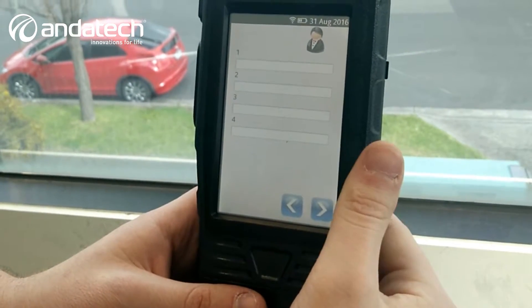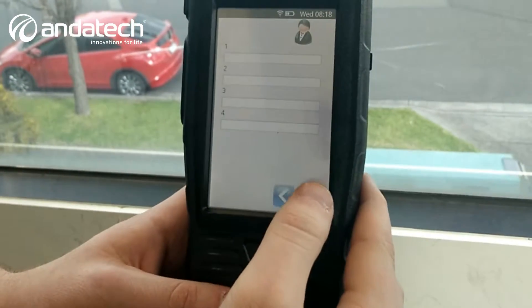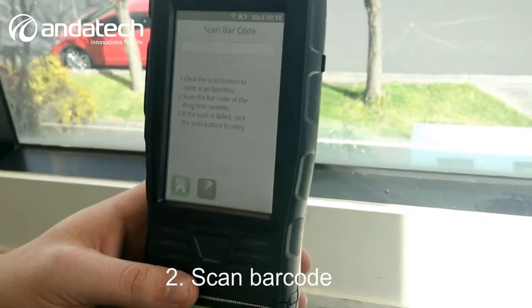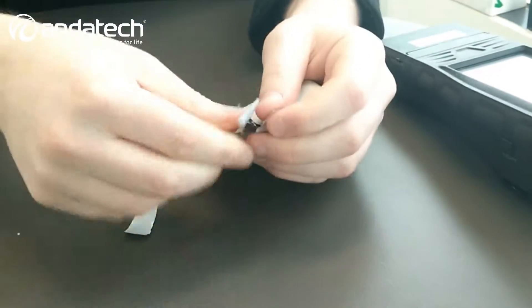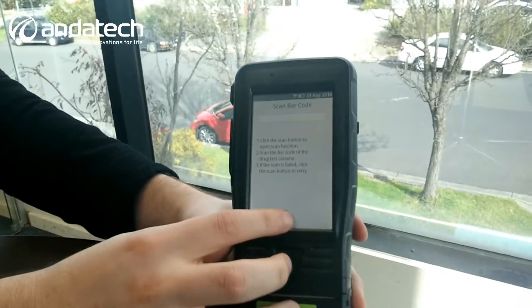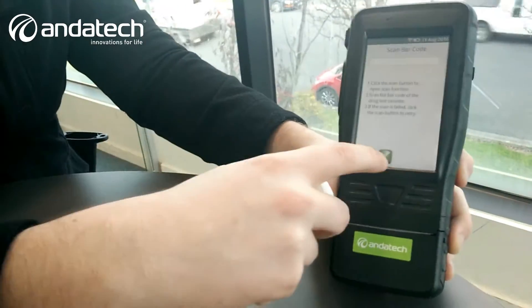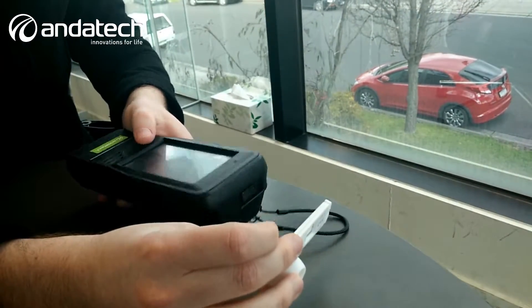You can also edit what other fields you'd like to enter — could be employee number, license number, and so forth. It all depends on what the company would like. Simply what we have to do is scan the barcode. We have the set ready, simply open it up, make the swab, and click set. We press this button here to allow the scanning of the barcode, which can be found on the back. The light is up and it's been scanned.